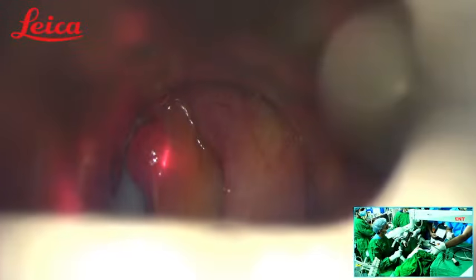So 1 millimeter size of the blade. So here I am using the blade. Earlier Akshay used the acute point. So I am using the blade to put the incision very close to the lesion.